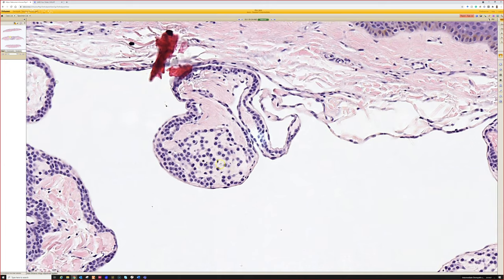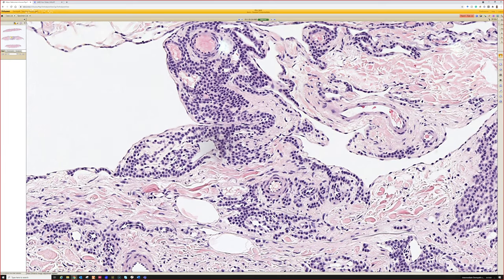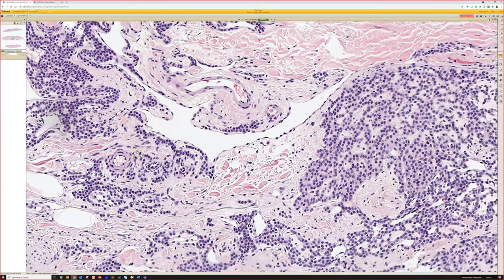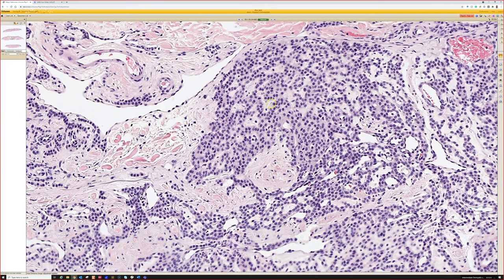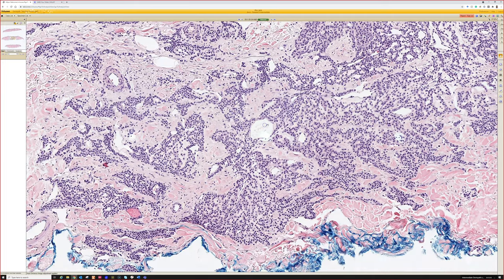The other thing is usually each individual cell is very discrete. If you do a PAS stain or a collagen type 4 stain, you don't need to, but it's pretty if you want to do one for education. Usually individual cells are lined and wrapped by a layer of basement membrane, and so it gives each cell a very discrete look that's distinct from its neighbors. So that's glomus. The cells themselves will stain with smooth muscle actin.